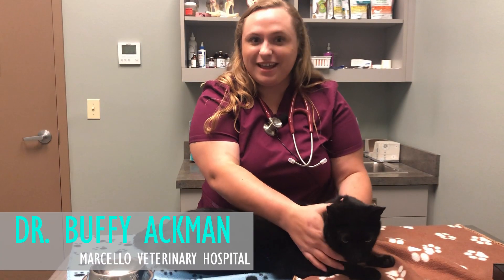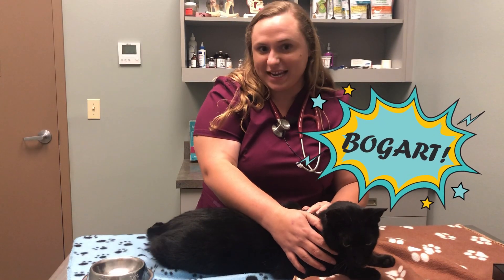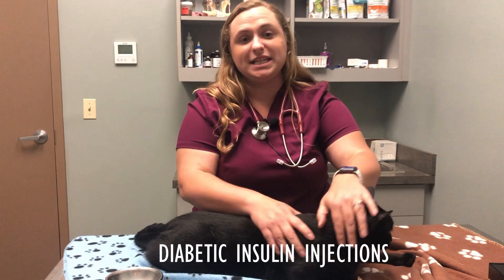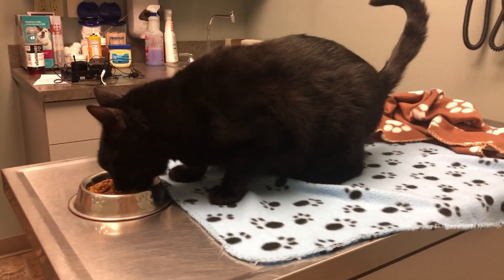Hi, I'm Dr. Buffy Ackman at Marcello Veterinary Hospital and this is Bogart, Dr. Kevin's diabetic cat. Today I will be demonstrating how to give a proper insulin injection. This includes making sure Bogart has eaten at least half of his meal.